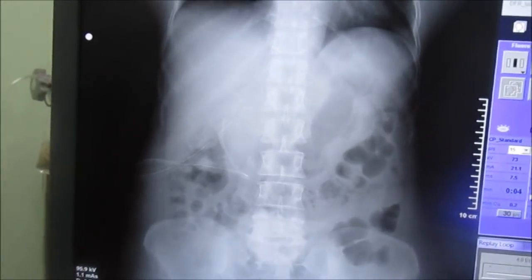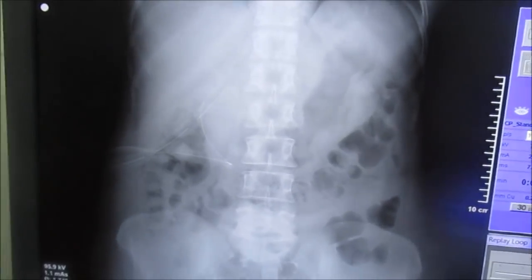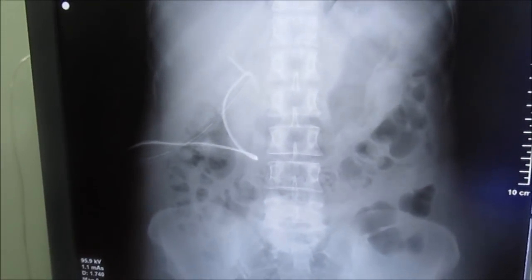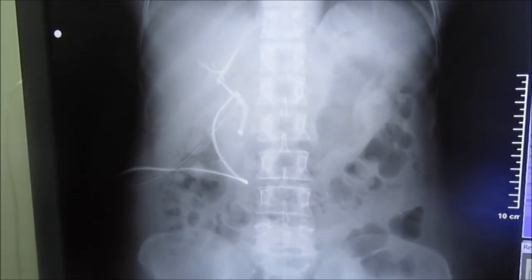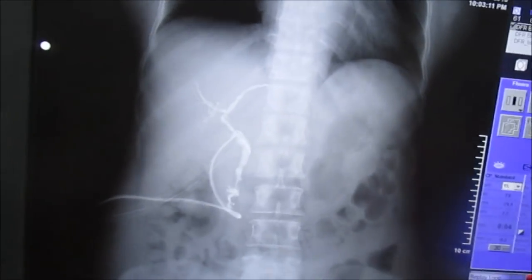This is the actual path of the T-tube as you can see in the video form. Thank you for giving your valuable time.